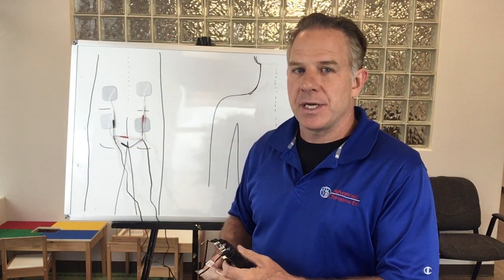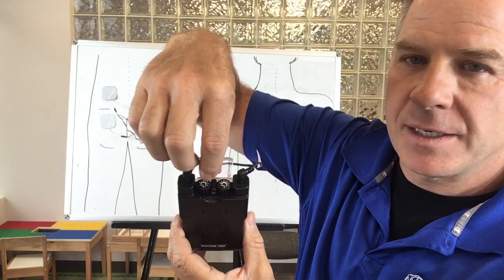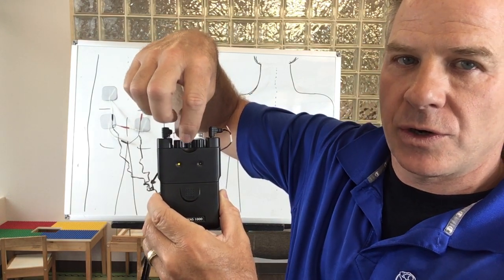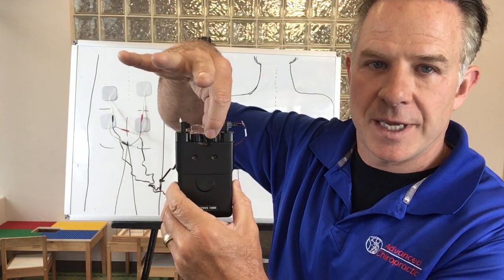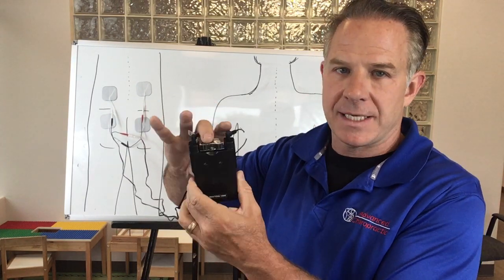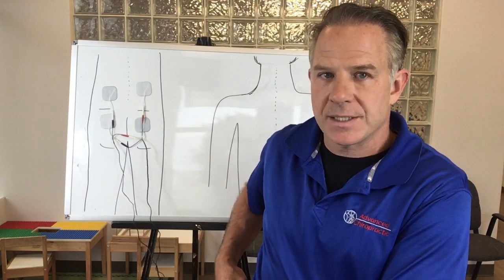After the pads are in place, take the TENS unit — which will already be set up — open the little cover, and slowly turn the dial. You'll initially hear a little click and see the light come on. Slowly turn the dial up until you feel the electricity strong but still comfortable. Then go to the other dial, turn it on, and turn it up until you feel it strong but still comfortable. After that, close the little plastic lid so you don't accidentally bump the knobs. These TENS units have a little hook so you can clip it to a belt, your pants, or just put it in your pocket.